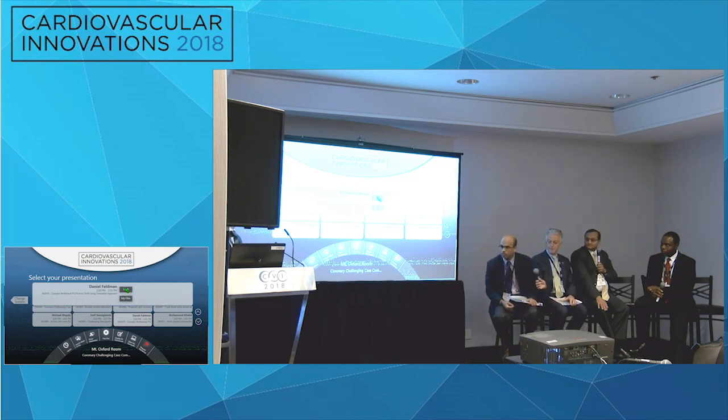I have a question for you. Sure. So if this patient did not have peripheral vascular disease, would you put an Impella in this case? I mean, that's another thing to think about with severe AS, crossing the valve with the Impella. Do you have any practical experience with that? I don't. I asked my attending about it, and in his experience, it's been done. It's not well tolerated.